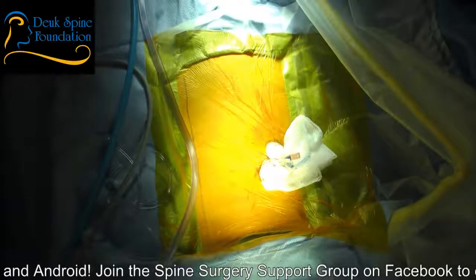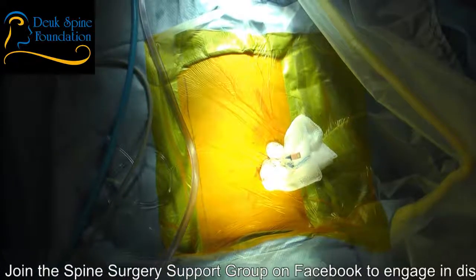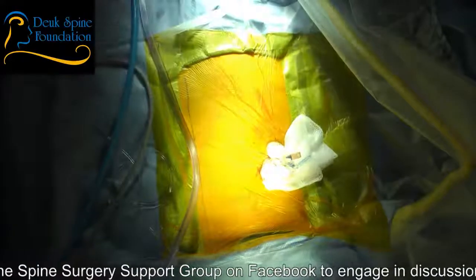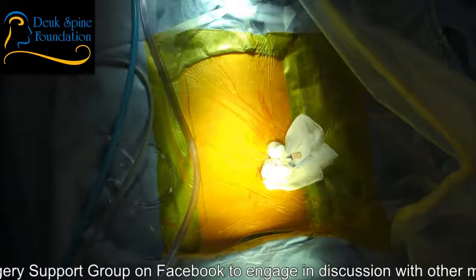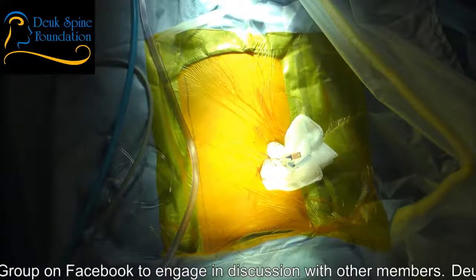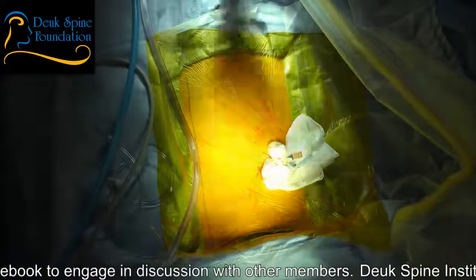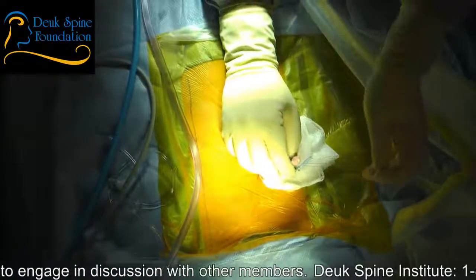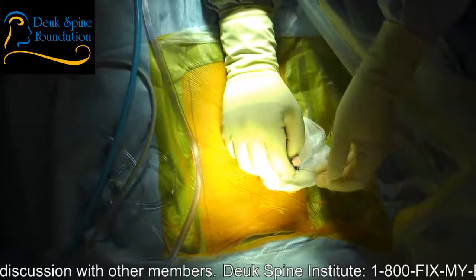Let's move the fluoro south 1 inch, just barely. I want to be able to see that 5-1 disc better. All right, that's good, right there. I can see the pseudo disc, the fake disc. It's the next one down. So I know I'm in the right place. I can see the herniation. This is what you call a grade 5 tear. It's the worst tear you can get, and it's got a big herniation associated with it, extrusion. That's what he's got.